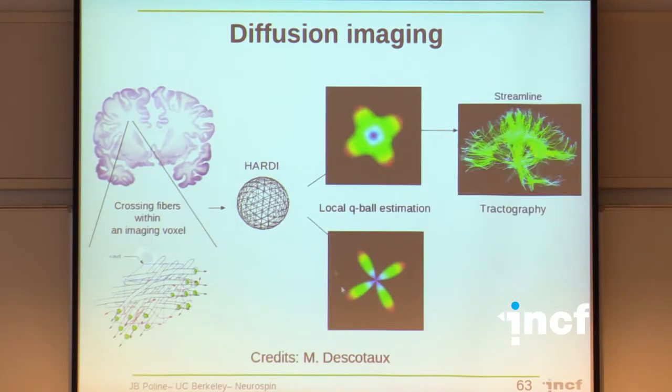So that's, for instance, the kind of diffusion probability count. What's the probability of the diffusion in space? Each voxel, that's an interesting modality. Each voxel can be a little 3D image itself, where for each voxel you have the direction of how much diffusion you have in each.